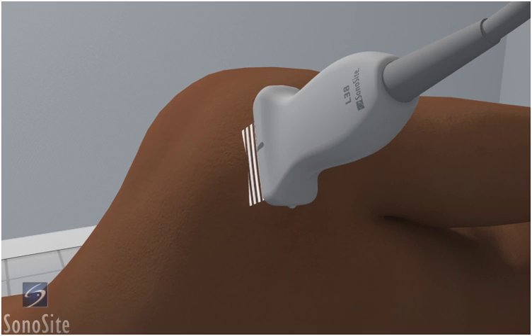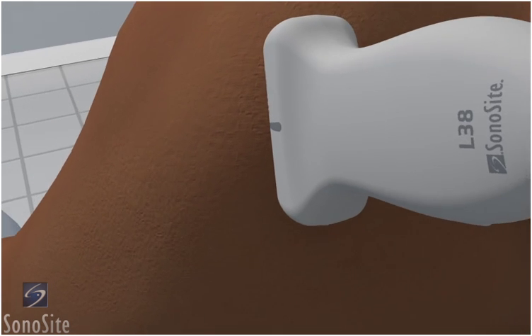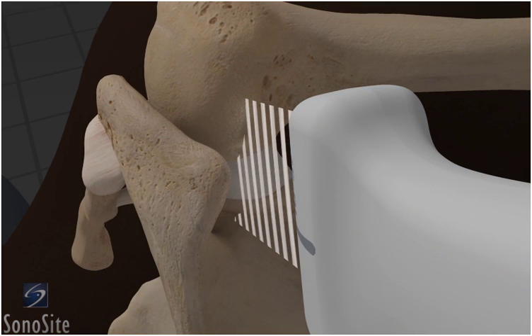The patient is in a lateral decubitus position with the arm flexed across the body. The examiner is positioned behind the patient, and the transducer is placed posteriorly over the head of the humerus with the orientation marker directed to the patient's right.